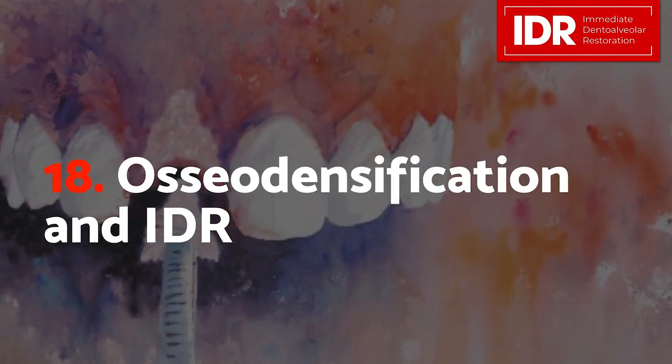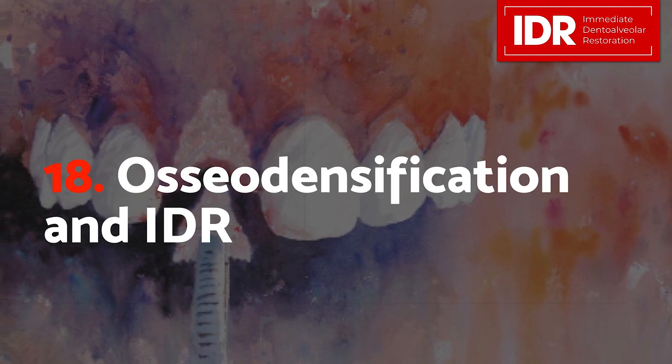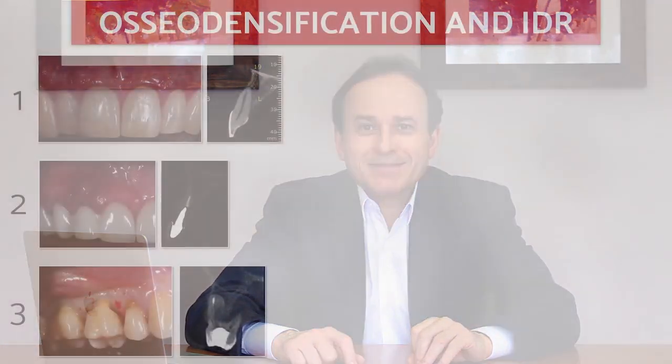Module 18, Osseodensification and IDR. Another possibility to improve implant primary stabilization is the association of IDR and osseodensification in cases with low bone density or the combination of severe bone loss and low bone density. Let's have a look at three different scenarios.